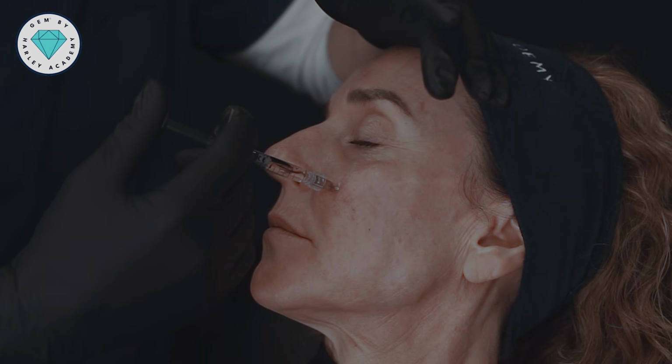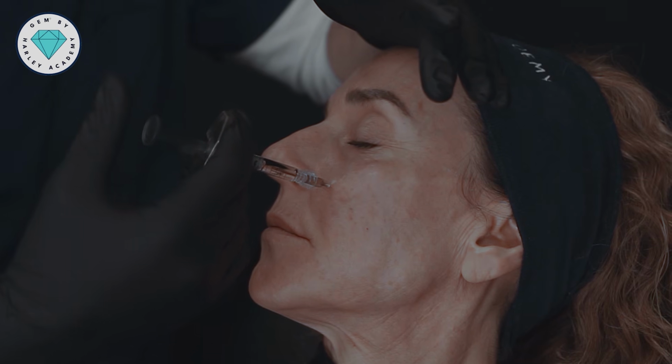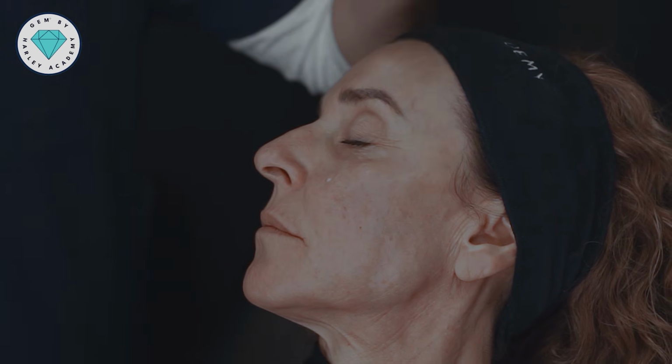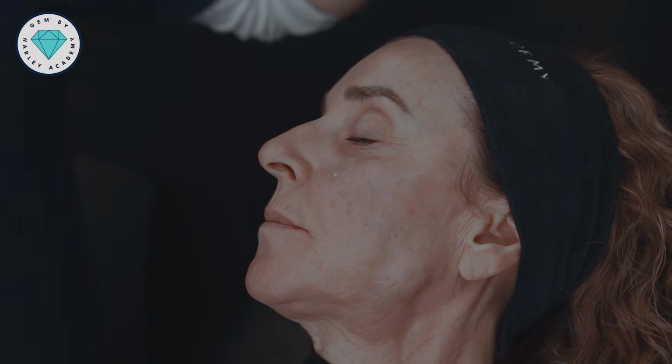The great thing about Shape is that it's so cohesive as well, so that it will stay in that deeper plane. Good. Thanks, Max.